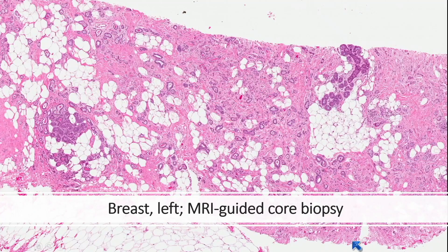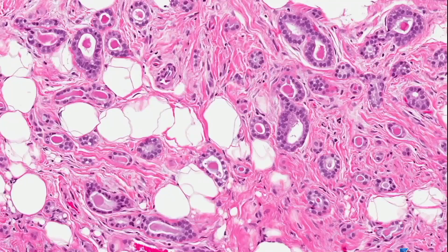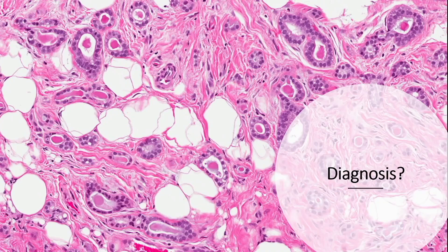This is a low-power view showing an infiltrative process. At higher magnification, we see some small glandular proliferation infiltrating the stroma, some in the fat. And at high magnification, we can see the cytological details of the glands. So — diagnosis.